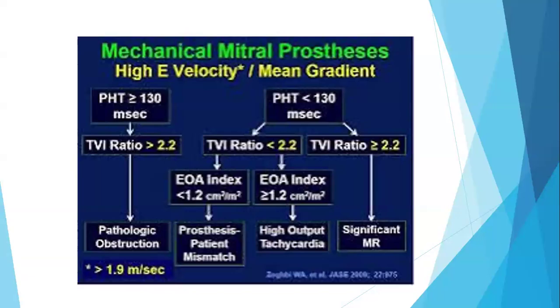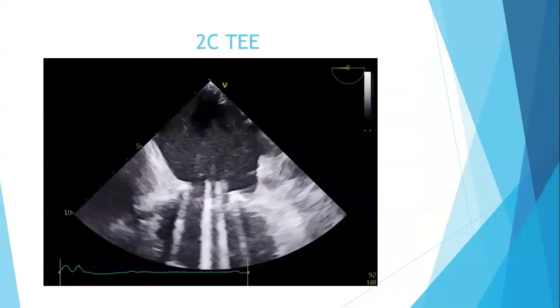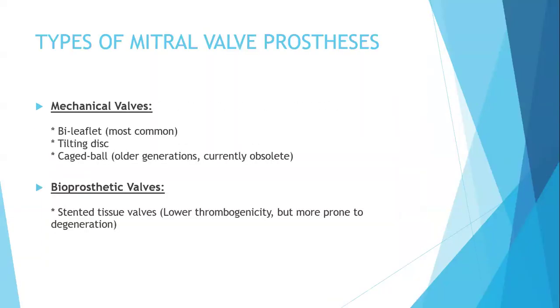Okay, this was our case. Eventually, we will take a very brief moment to discuss the parameters to be measured.